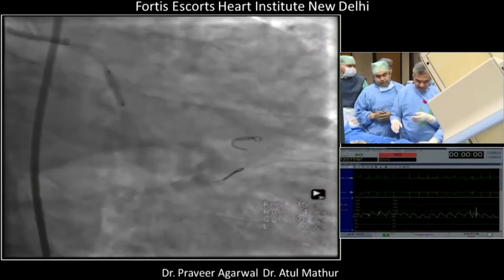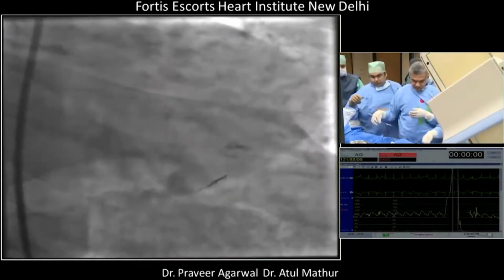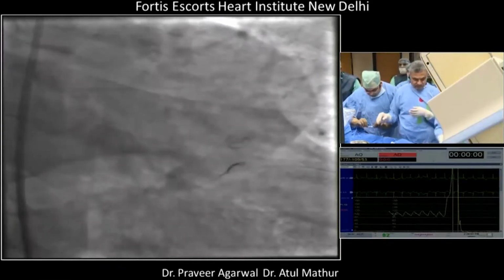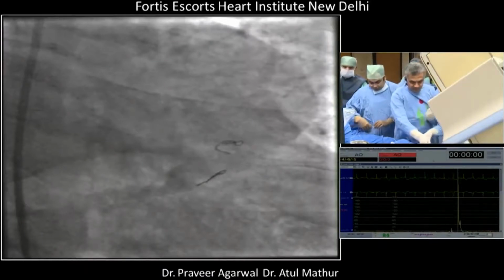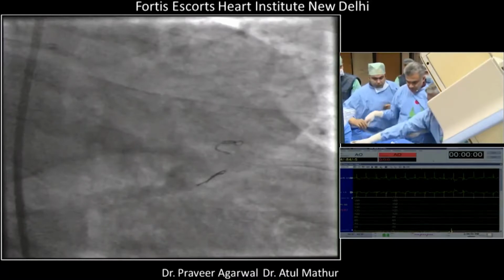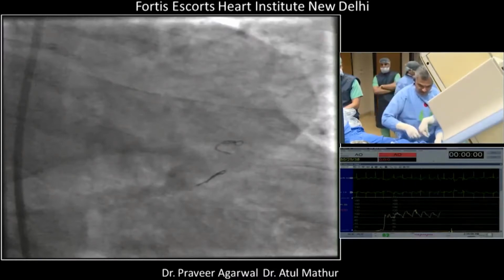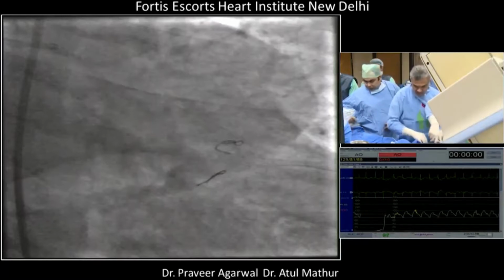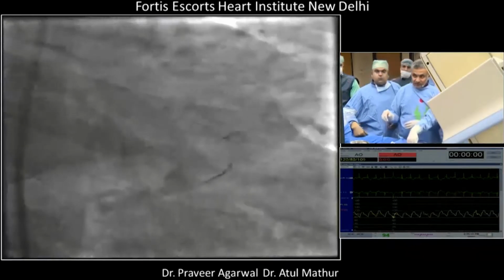Okay. इसको निकाल दीजिए पहले balloon को. Right. So that's it. This is compared to provisional, you have to cross from the proximal cell for the other balloon. DK crush to get a better stent apposition. Yes. Sometimes there's only one cell, half a cell. Balloon out, then we take a shot.